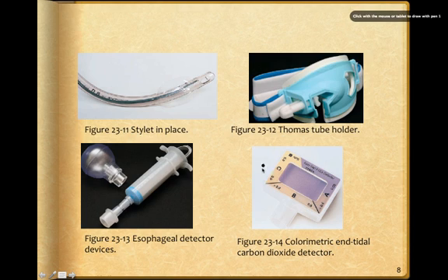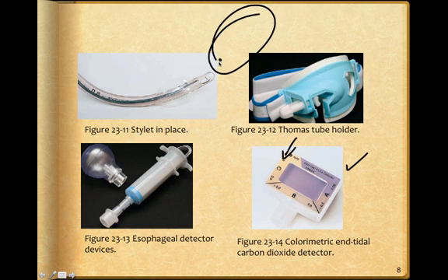This here is a colorimetric end-tidal CO2 detector. And if it comes into the presence of CO2, it changes colors. And the color to remember is as good as gold. So it's going to turn a golden color, about the same color as the slide set here.